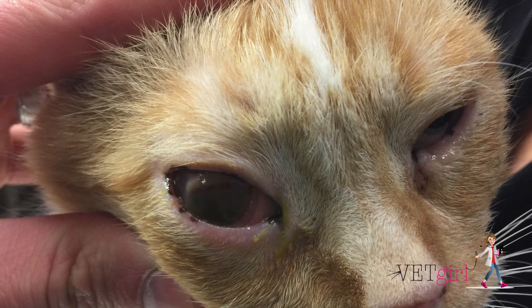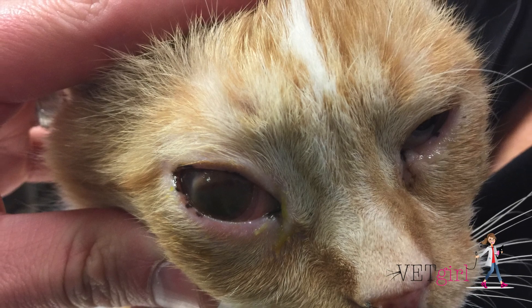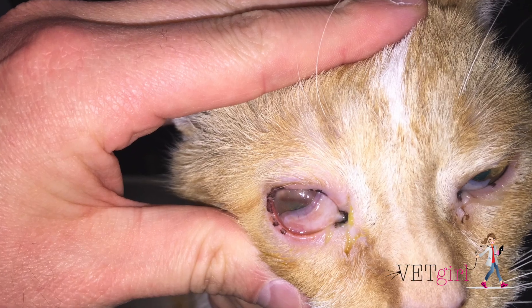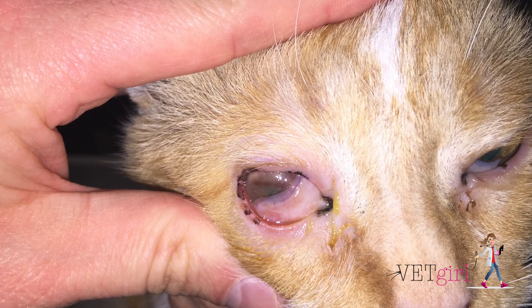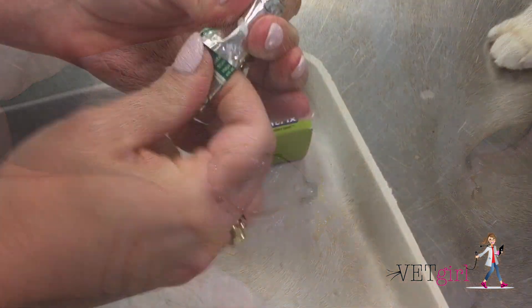In this video, we have a 12-year-old male castrated domestic shorthair presenting with conjunctivitis and corneal changes. Closer examination reveals a pink to white film on the cornea.